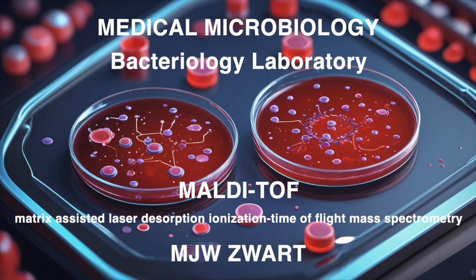So we've talked about daily validation, creating the import sheet, prepping those samples, even cleaning. Anything else before we move on? Just a few end-of-day things, like a process they call specroname for converting the data, and a little reminder to lock that computer and restart it on Tuesdays. Even high-tech lab instruments need their weekly reboot.